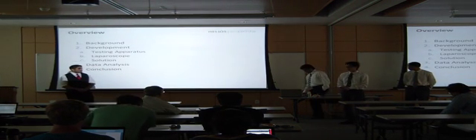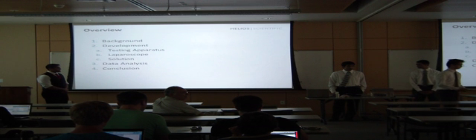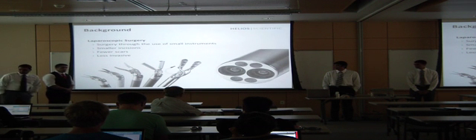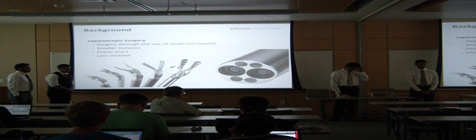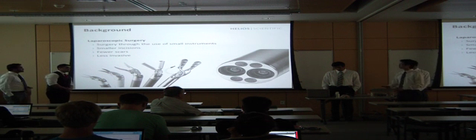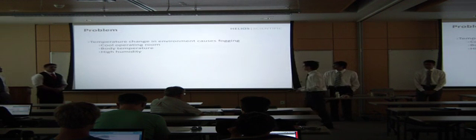Okay, so today our group will be going over the background and motivation for our project, as well as the development, data analysis, and conclusion. Laparoscopic surgery is a relatively new technique which allows the surgeon to use smaller tools to protrude into the patient's body. These tools give us smaller incisions, fewer scars, and are less invasive. This is advantageous because it allows the patient to recover much quicker.